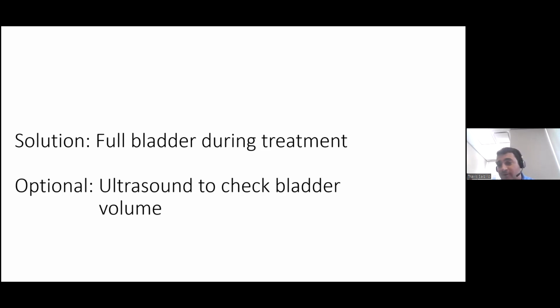Again, for long treatments, for SBRT treatments, we also have to image halfway through treatment sometimes, because on the order of minutes, you could see that the bladder volume changes by 2 or 3%. And so if you have a 15-minute treatment, that kind of bladder filling motion can also impact your treatment within the fraction itself. But you can see these again with ultrasound, if you have an ultrasound in the room, or in cone beam. If you use a cone beam CT, you can see the bladder very clearly, and determine if it's gotten too big or if it's not big enough yet, relative to your treatment plan.